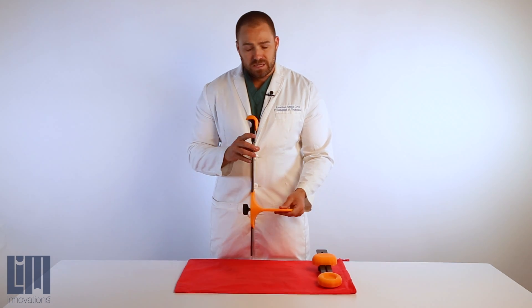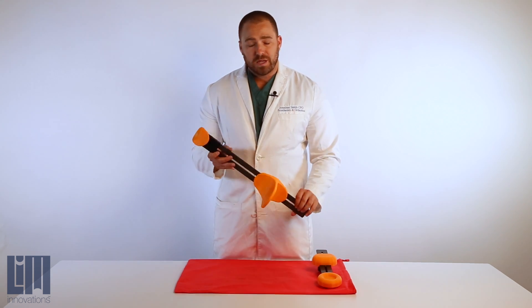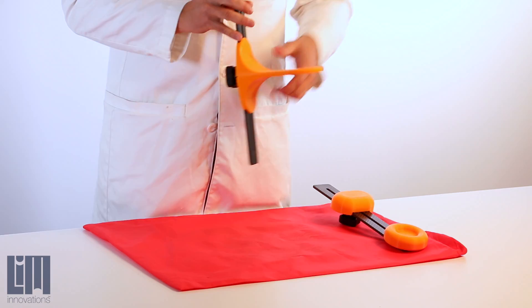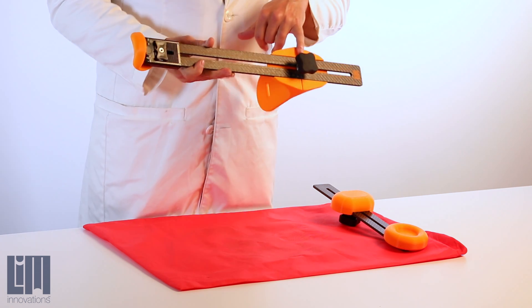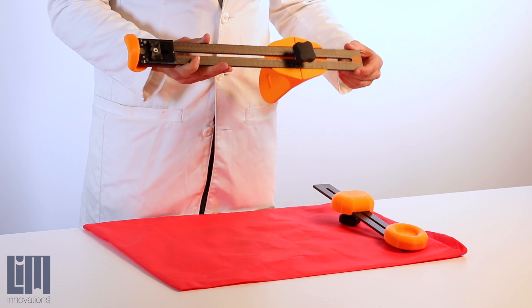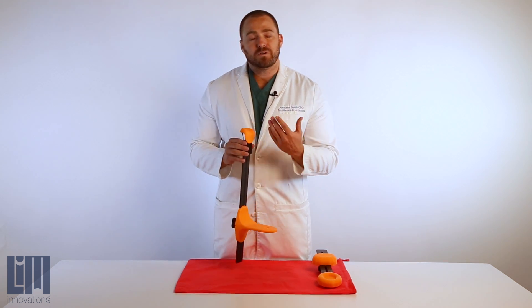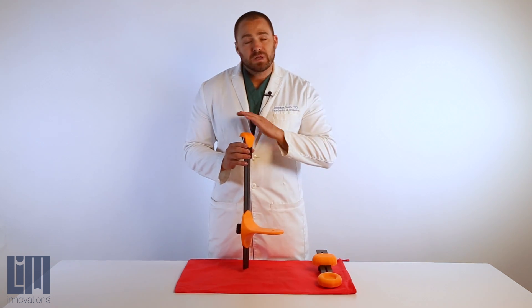The first is the ischial seat and length gauge. This portion doubles as both a length gauge, where we have the ischial U-channel seat, as well as our moving length gauge to give us the length that we require on the infinite socket order forms.